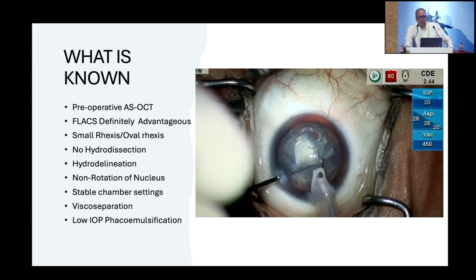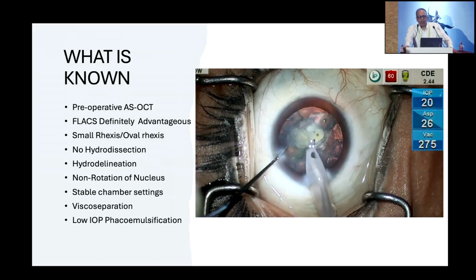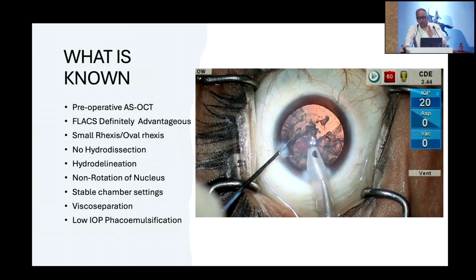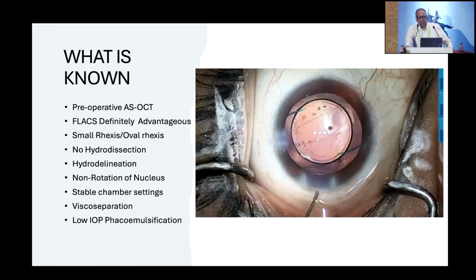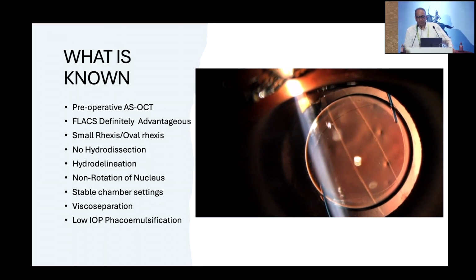Now what does this low fluidics do? It creates a situation wherein there is no rush of the fluid into the anterior chamber. There is no chance of the anterior hyaloid face being broken. So you will find at the end of the surgery how things have come out. With the low fluidics, I was able to keep the same size of the posterior capsular rent which was there initially, and it ended with a beautiful IOL implantation after IOL capture.